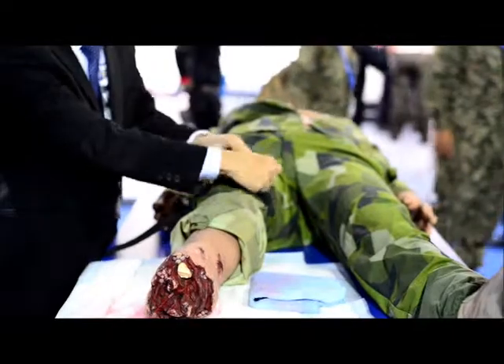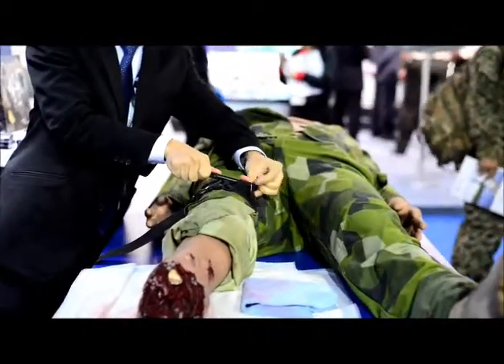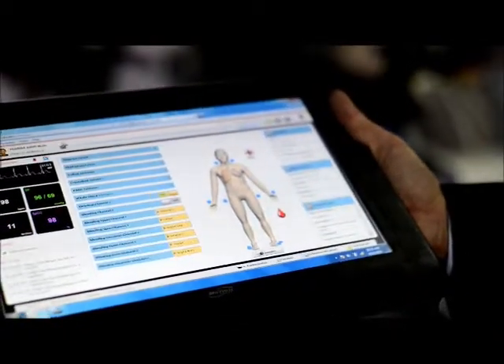Upon giving the right medical interventions we will be able to stop the bleeding. In all simulation training we will be able to get feedback into the instructor's PC telling him that the appropriate medical treatment has been given.